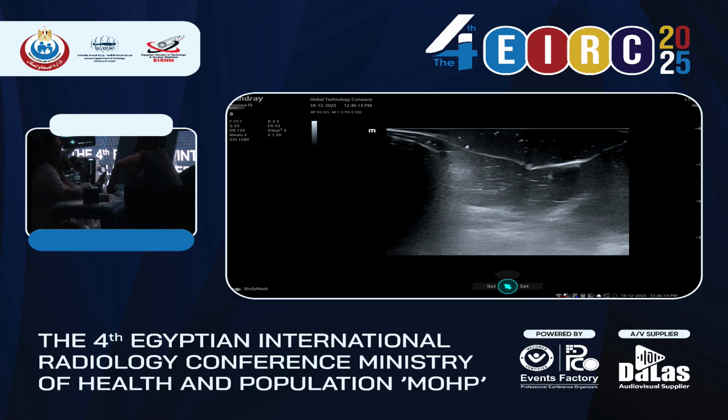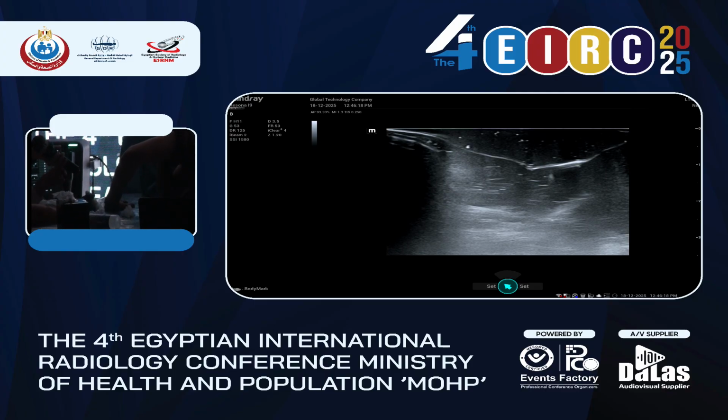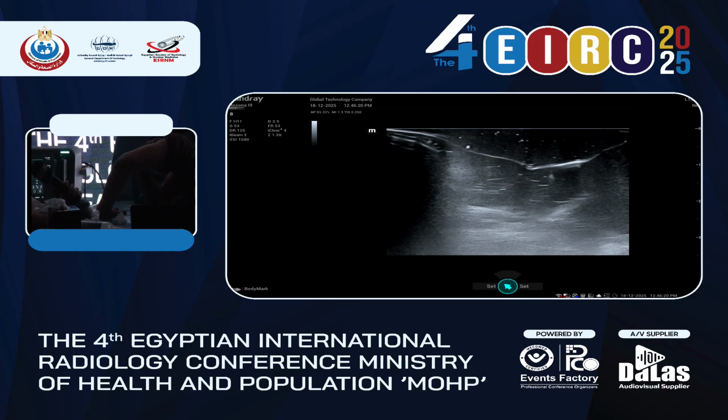We will start with the ulnar nerve. If you are starting with musculoskeletal sonography, I suggest that you find the ulnar nerve at the anatomical landmark which is most easily found. And this anatomical landmark is the cubital tunnel. The cubital tunnel is very characteristic. Everyone can find it, even if we are inexperienced.